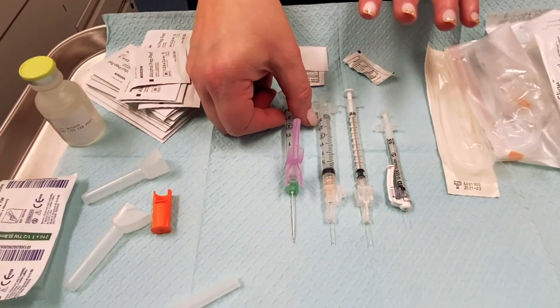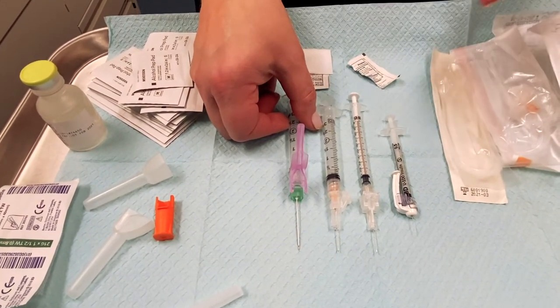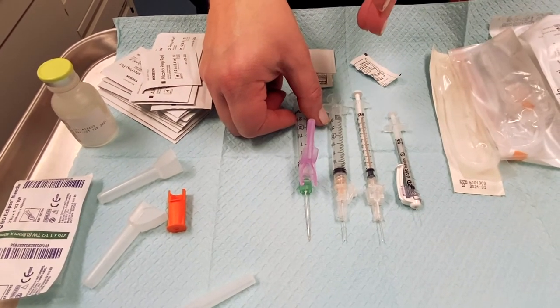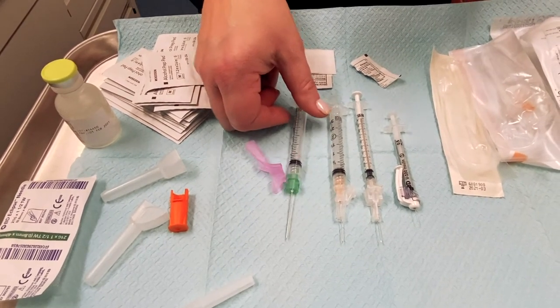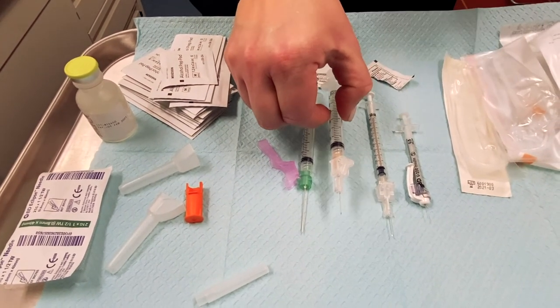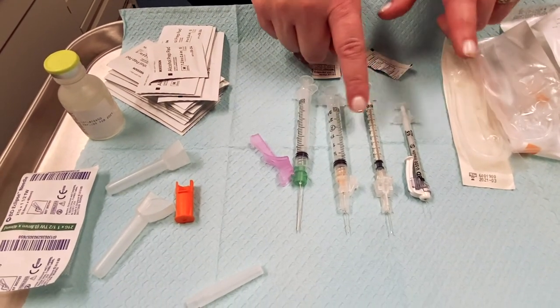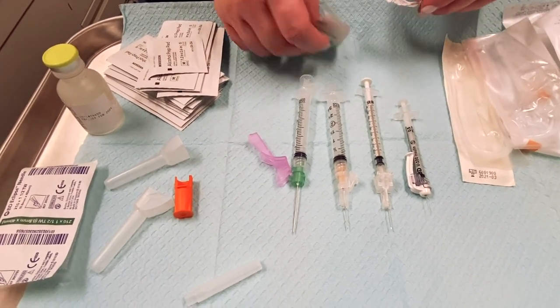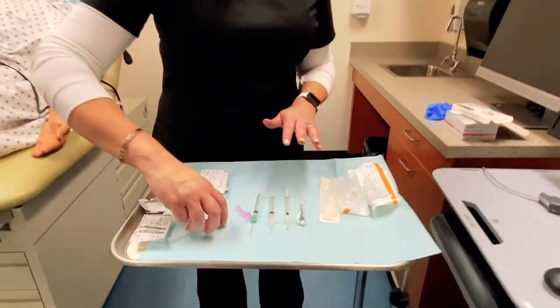That should give you an idea of how to select which needle to use when you begin to do the injection. If I tell you that you're doing an IM injection, you should know to select the bigger and longer needle because it's going to have to go down to the muscle layer. If you're going into the fatty tissue, select the 25 gauge 5/8 inch syringe. And if I tell you that you're doing TB or insulin, you should be able to differentiate between those two and select the appropriate one. That's it for needle and syringe selection — if you have any questions, let me know.